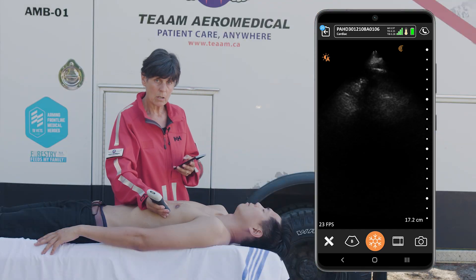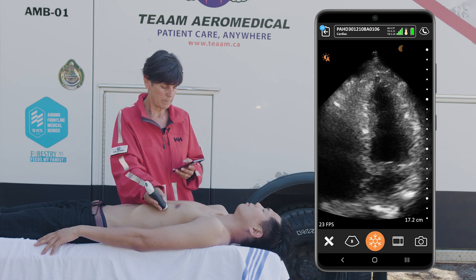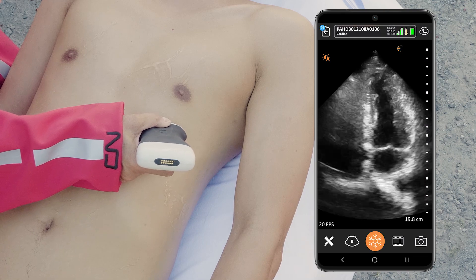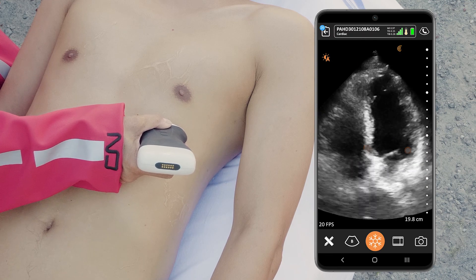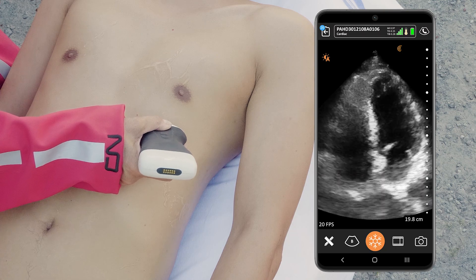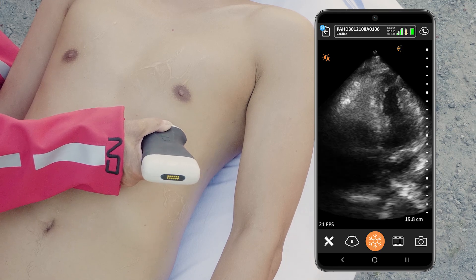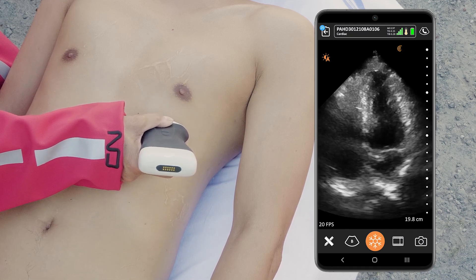Now I'm going to go to the apex of the heart and we'll have a look at the apical four-chamber view. This gives me a really good idea of ventricular size. We can compare the right and left ventricles here — they should be fairly similar, with the right side a little bit smaller than the left. We can also see the septal and lateral walls of the left ventricle, as well as both the mitral and tricuspid valves, to see how well they're moving.